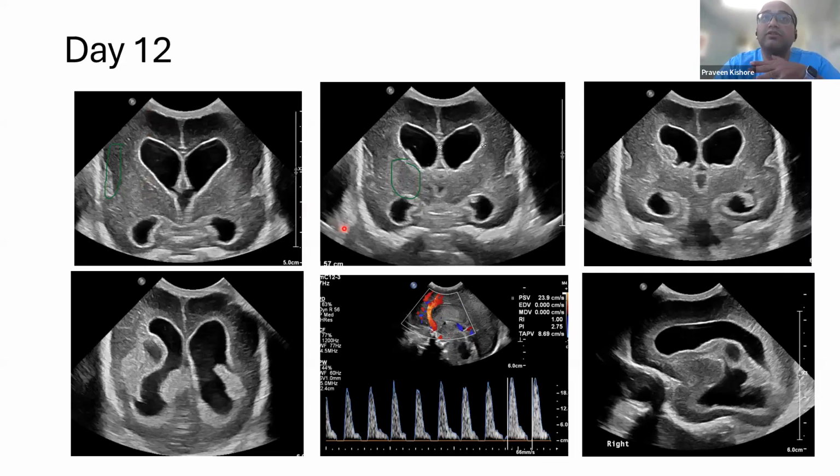The other way to differentiate would be to look at the clinical picture, at what the CRP is doing, what the white cell count is doing. So I take your point, very well picked, that the brightness of the walls of the ventricles can point to ventriculitis. However, in intraventricular hemorrhages you will find an enhancement of the walls of the ventricles. So this was not a ventriculitis, but I agree you should always keep an eye out for ventriculitis. Shall we go to the next slide?